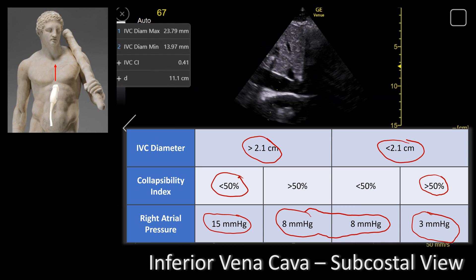In this particular patient, the maximum IVC diameter is 23 mm, which falls into the greater than 2.1 cm category, and the collapsibility of the IVC is 40 percent, which is less than 50 percent. So the right atrial pressure in this patient is 15 millimeters of mercury.